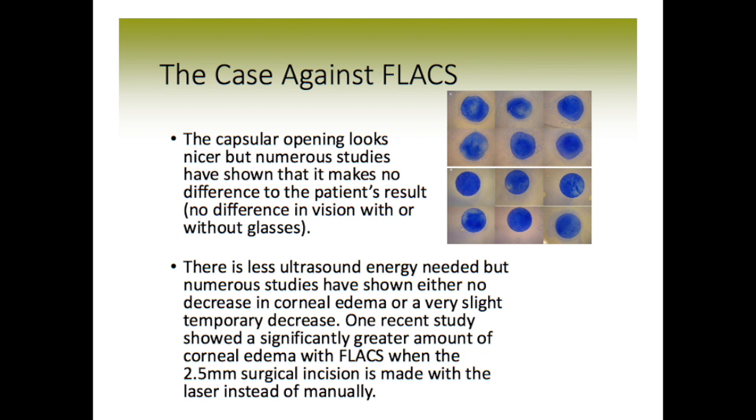How about the case against FLACS? Well, they talk about a perfectly centered and very round capsular opening, therefore leading to a better position of the implant and therefore leading to better vision, either with or without glasses.